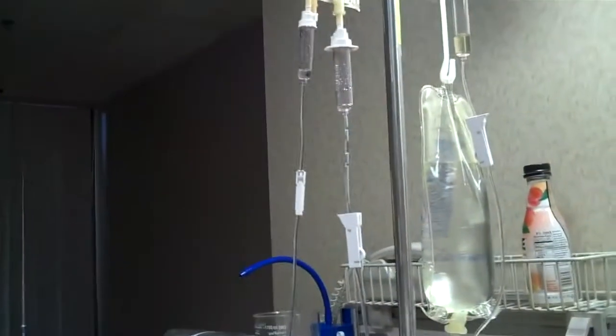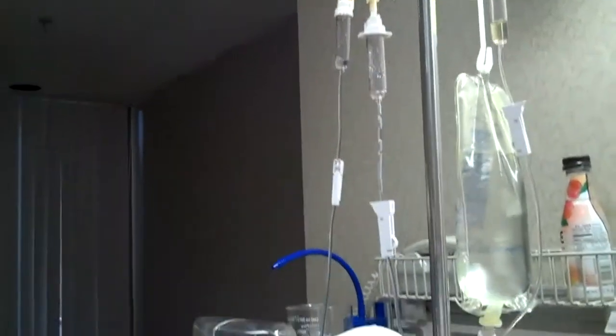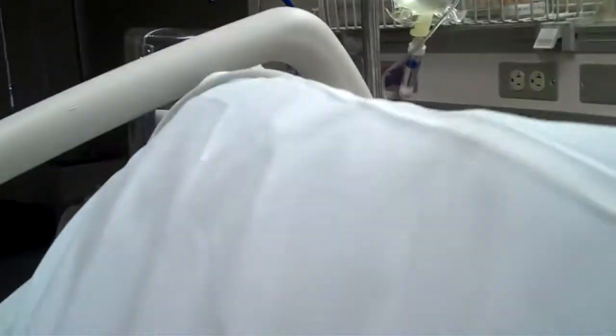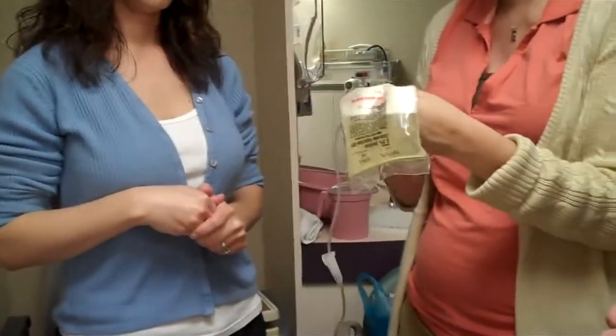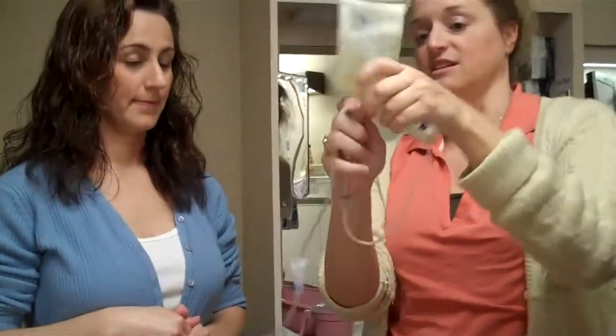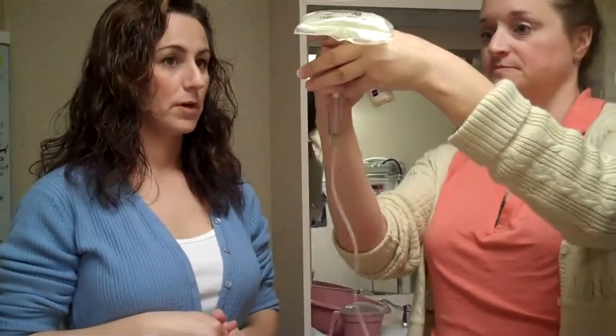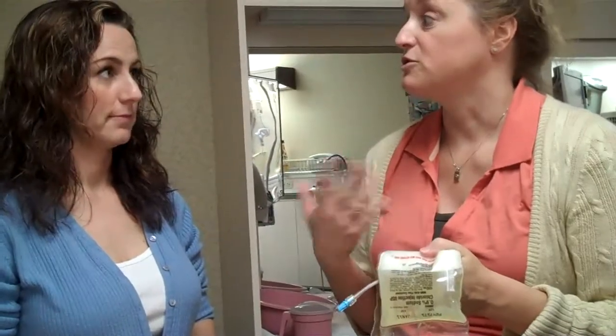And you can see here how one looks. This is kind of what your bag is. So tomorrow, when you go to use the bag, you're going to pull this blue cap off. You pull this white cap off. Everything's sterile underneath, and you push and turn and you spike it so it looks just like that. So you will have a bag that looks like this. The one main question I asked my nurses today is, is it a drip? Will it have to be above him, or is it a push? It will be above him. This works on gravity. You do not need a pump.